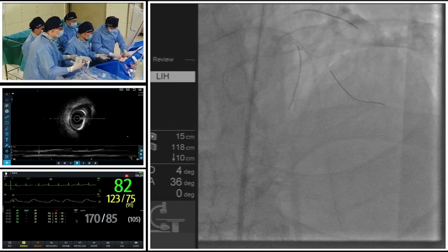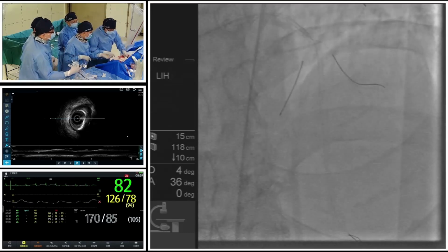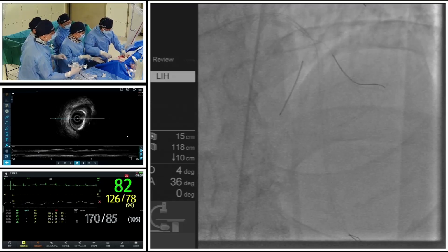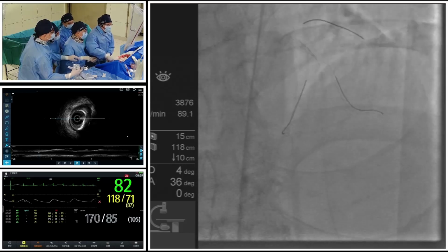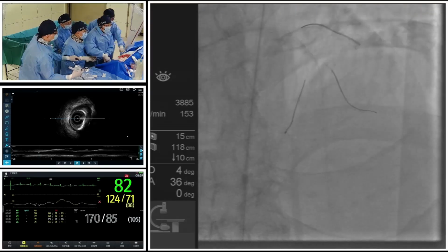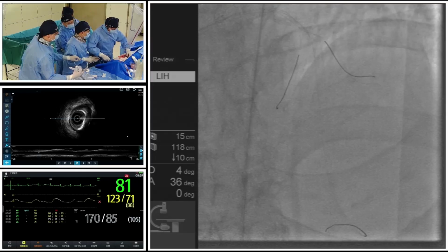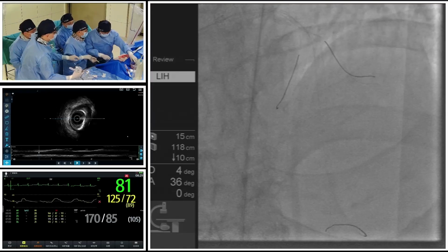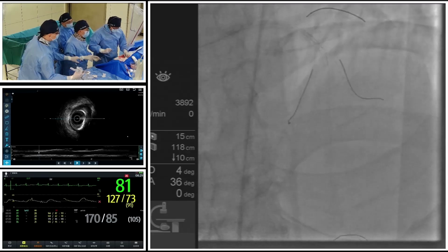Just like in this case, later we may check with the IVUS system the fracture of the calcium. So we can see the IVL system usage in the left main is relatively safe and also effective. We know the system can deliver 60 seconds of therapy in the left main and the non-left main disease, respectively, without any signs of increased harm to the patient.